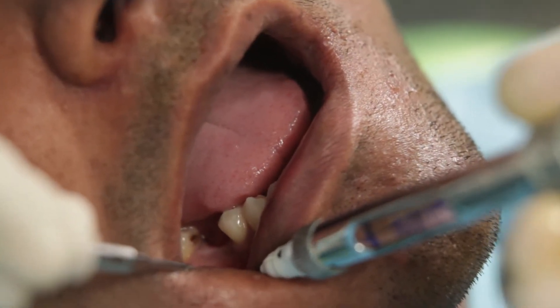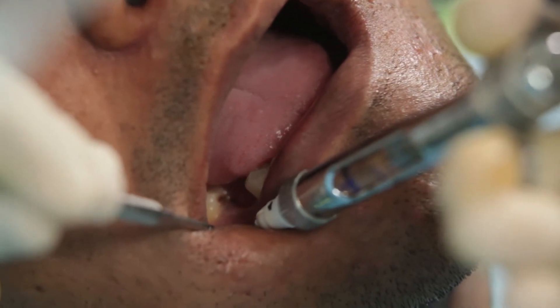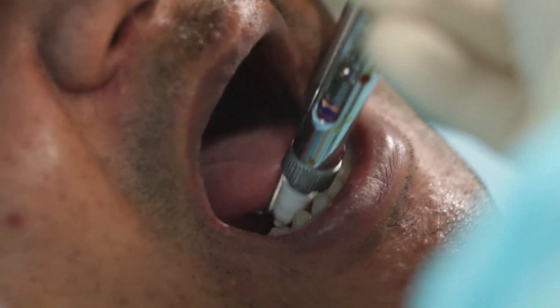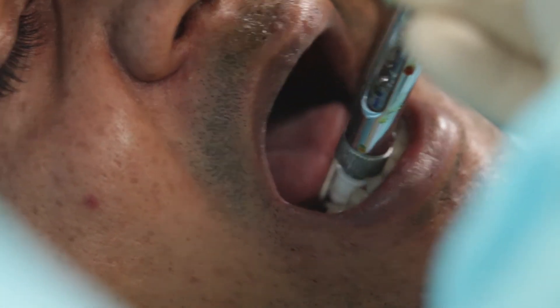Firstly, I will anesthetize my patient with some lignocaine. For an implant surgery, it is highly advisable to work under local infiltration instead of a nerve block, especially when you are working in the region of the inferior alveolar nerve.